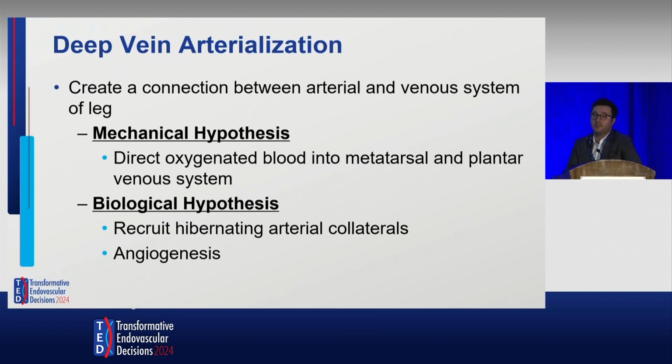There are some hypotheses, which at this point in time I think are all theoretical, about whether the mechanical component of creating a deep venous arterialization and sending blood into the metatarsal and plantar venous system will provide perfusion to facilitate healing, or whether this actual creation leads to the recruitment of hibernating arterial collaterals and fundamentally leads to angiogenesis.